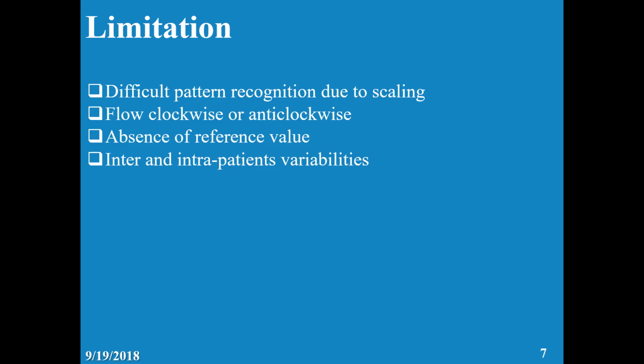Is the flow clockwise or anti-clockwise? Sometimes it can be clockwise, sometimes anti-clockwise. So it's a little bit confusing depending on the ventilator.